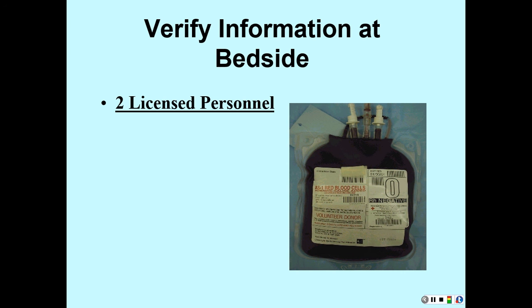We don't usually just flush it. If your patient is having a true reaction to where you're having to stop the blood flow, you're not going to just open up your saline to flush your blood out, because where's the blood going? Into your patient. So you can either disconnect it and flush it into the garbage can, and then hook the patient back up, or if you have another bag there, prime tubing and hook that up to infuse.